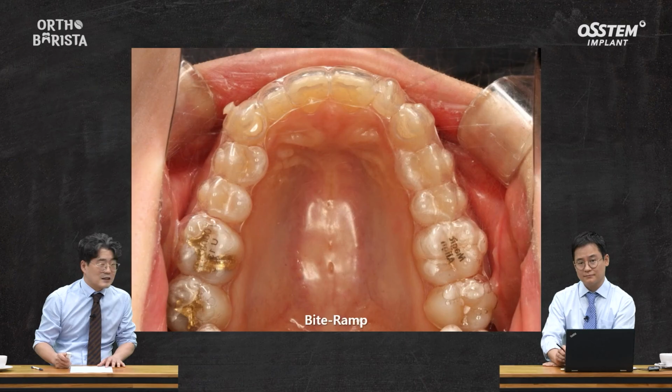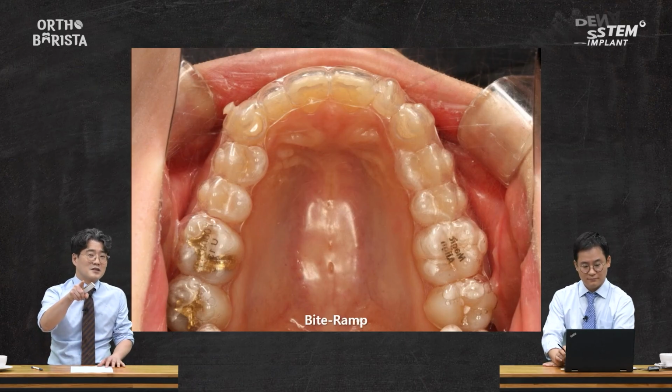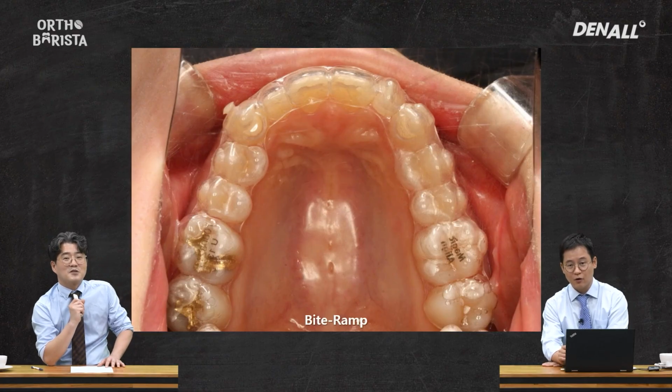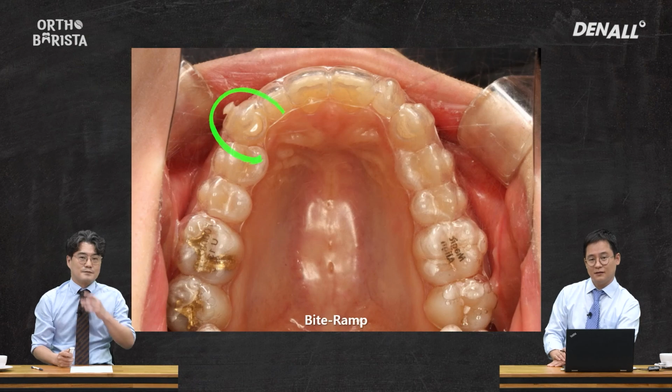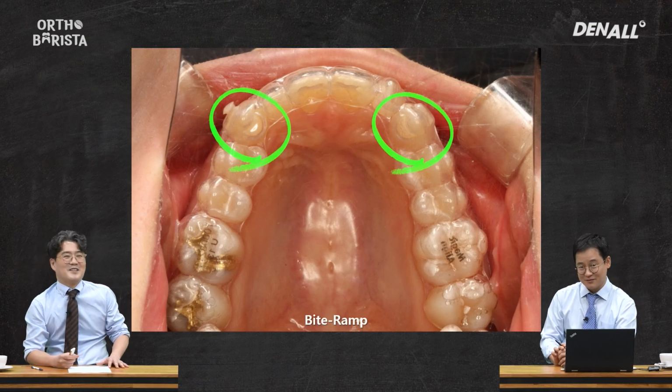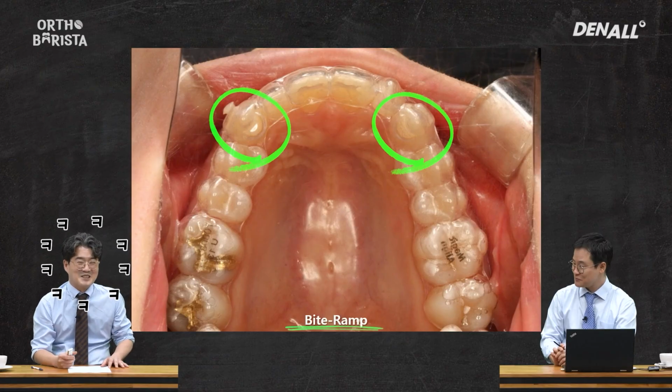This is after applying the 12th aligners. This is the upgraded Magic Align. Yes, I can see that. There are markings and gingival line cutting as well. Do you know what that is? Is it a bite ramp? Yes, it is a bite ramp. It is written there. Yes, that's right.